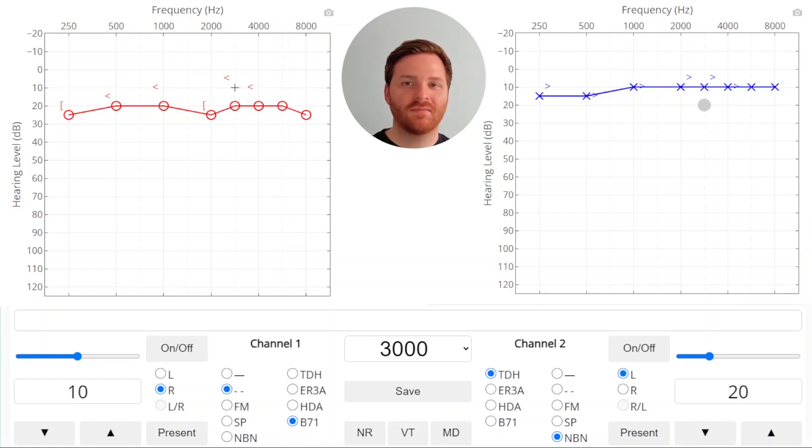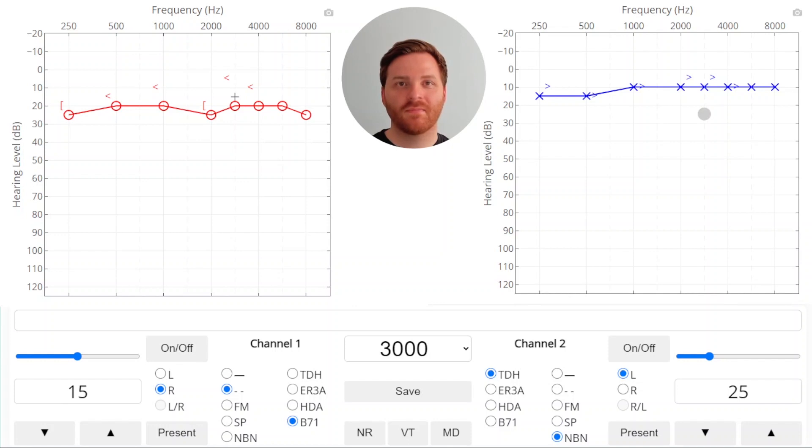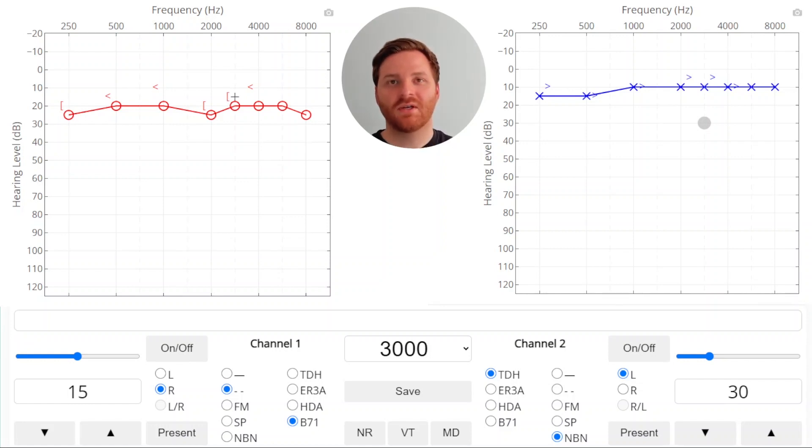So we'll raise the signal and raise it again until we get a response. Then we're going to raise the masker, and we got a response. So we'll raise the masker again, and we got another response. So we'll go ahead and save this as the masked threshold.